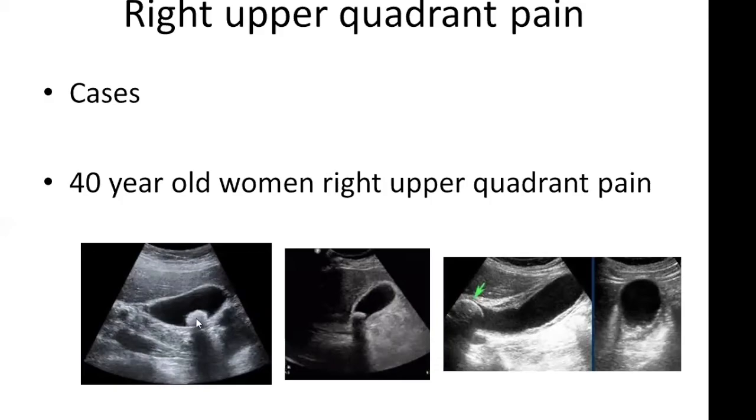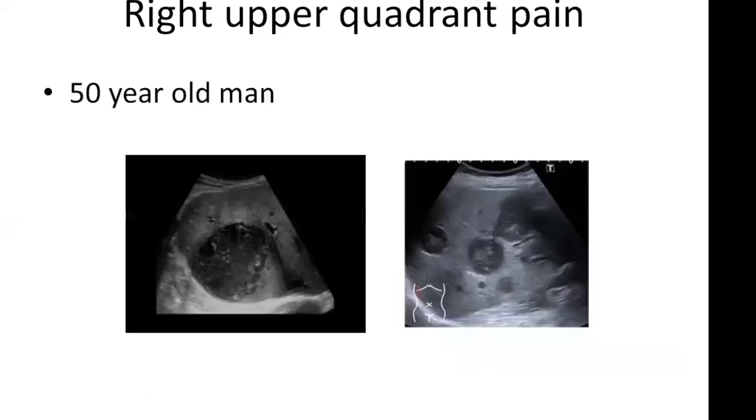Now, you can have biliary colic where this intermittently obstructs, the gallbladder contracts on it, and it causes excruciating pain. Then you get stasis and you can get infection here, that becomes inflamed and cholecystitis. This can turn into pus and become an empyema. This is a very common finding we find in patients with right upper quadrant pain.